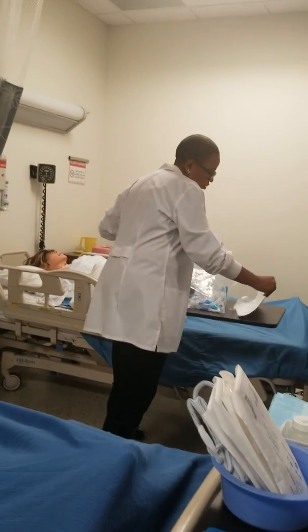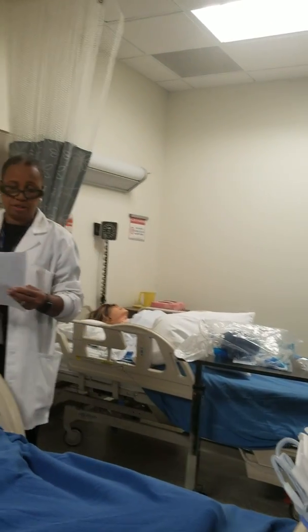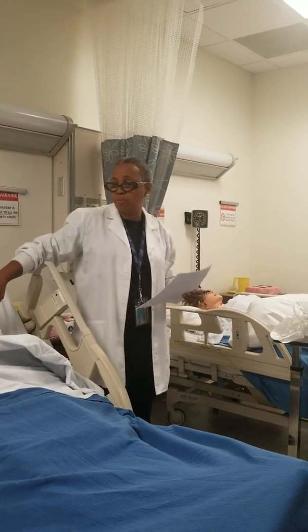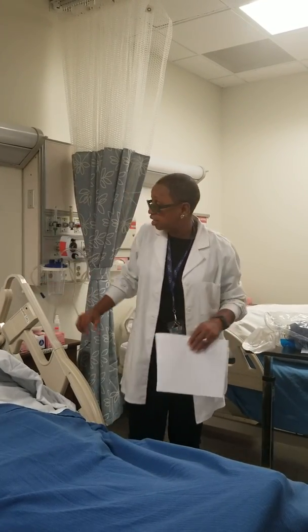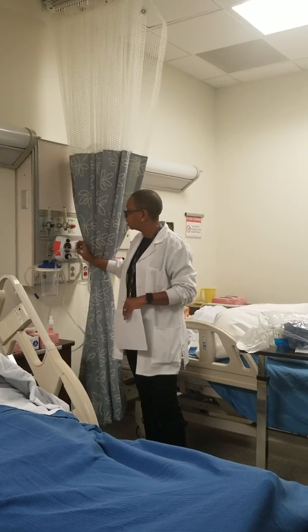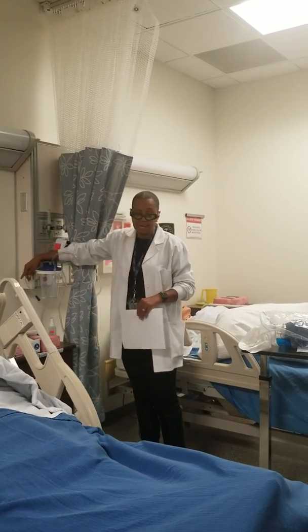Looking at your sheet, let's go down your sheet. Introduce yourself, perform, identify signs and symptoms of airway obstruction, okay? Explain the procedure, so you tell them what you're going to do. Most times people are with you and they have a trach, they have had it before. Obtain the vital signs. Then, like I say, check your suction machine. Make sure it's set up, make sure it's connected, turn it to continuous. What is the rate? 100 to 200. 100, 120. Go ahead and test it.